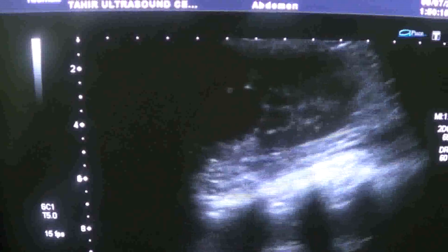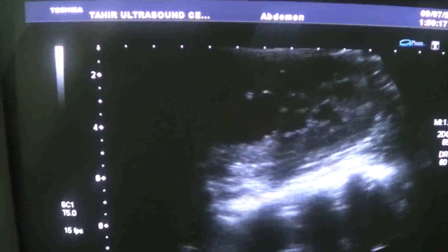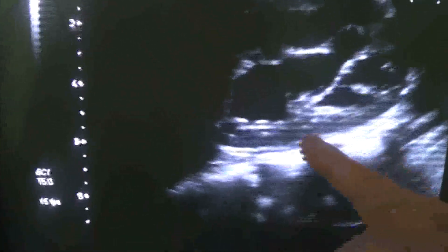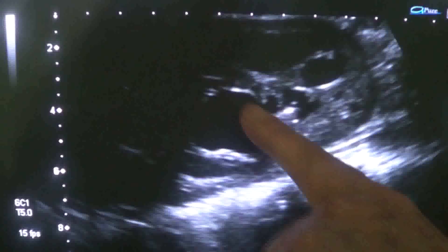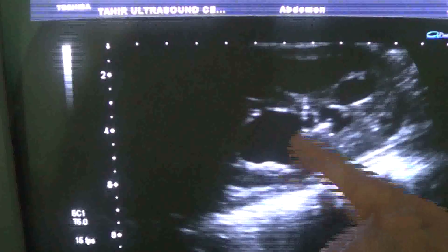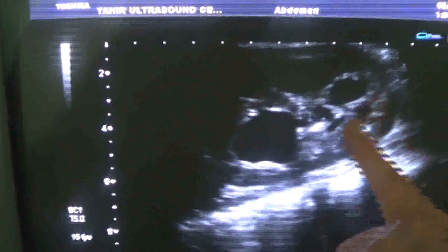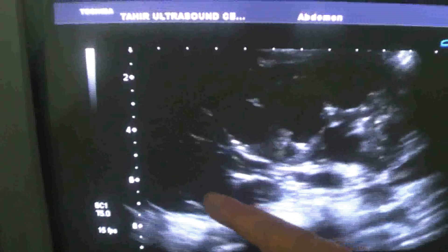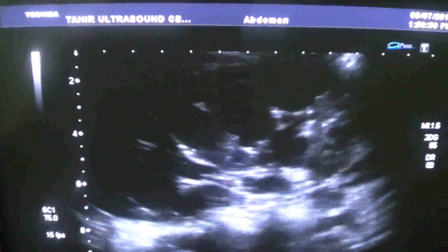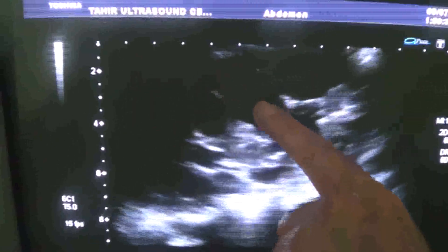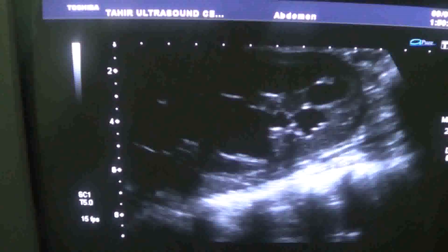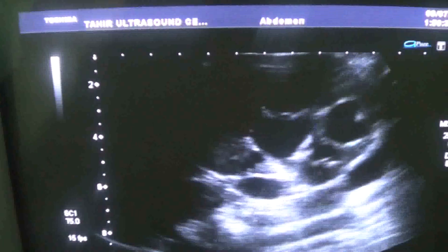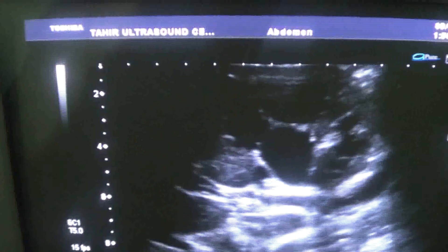The kidney is dilating. Otherwise the proximal ureter would have been seen here — this is the normal position. This is the pelvis of the kidney, lower pole, and here is the upper pole. All the calyces are seen dilating. Down here comes the proximal ureter.